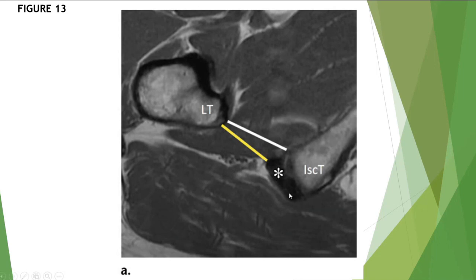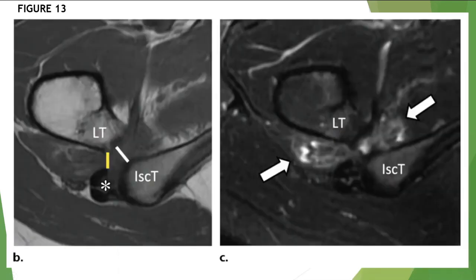So here we have image correlation with a pathologic condition. We'll have impingement at this region. We have here, in the same type of projection, the actual T1 weighted MR image, where these same distances are clearly reduced.